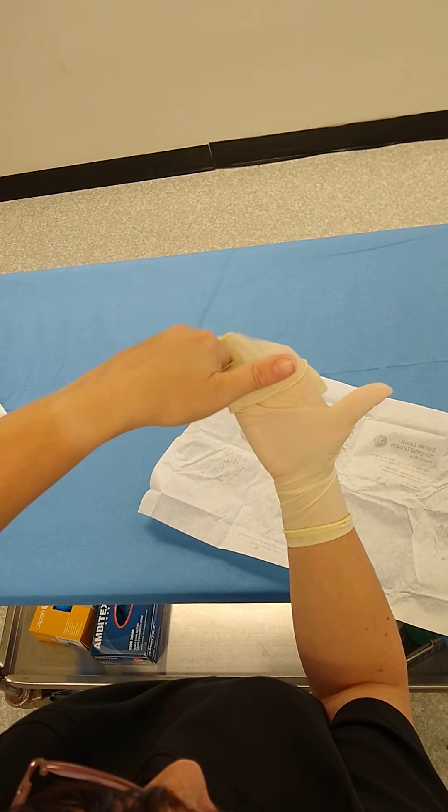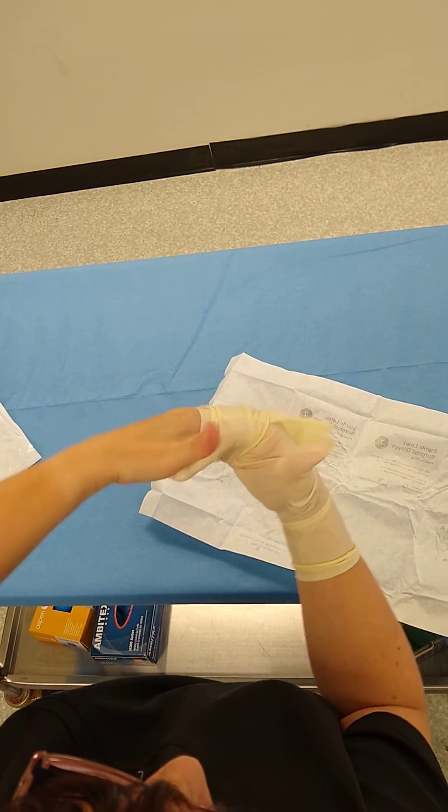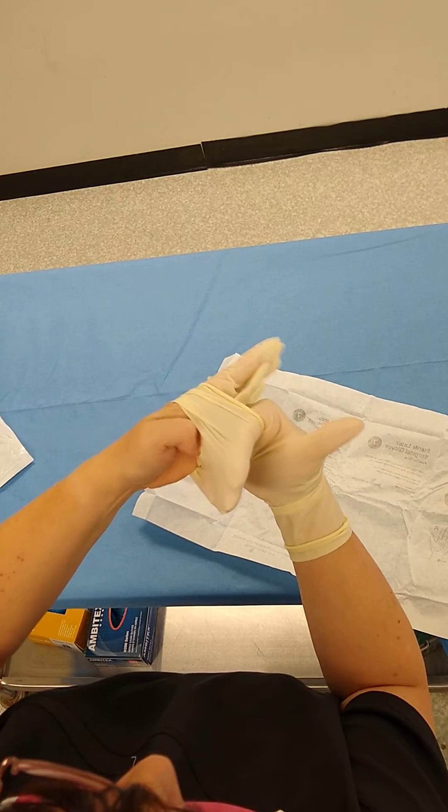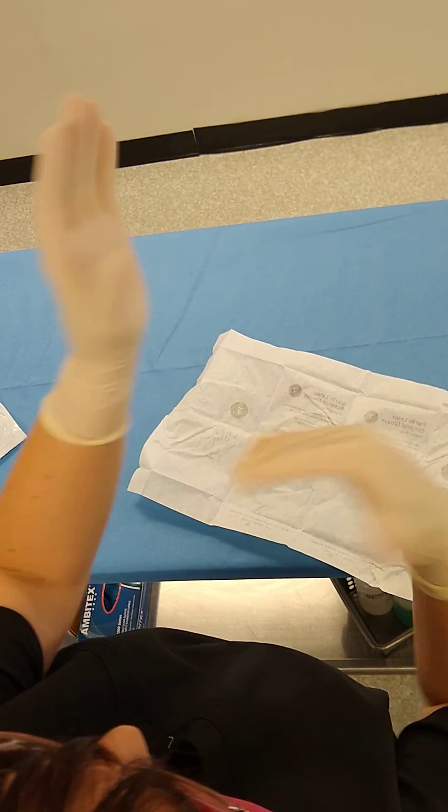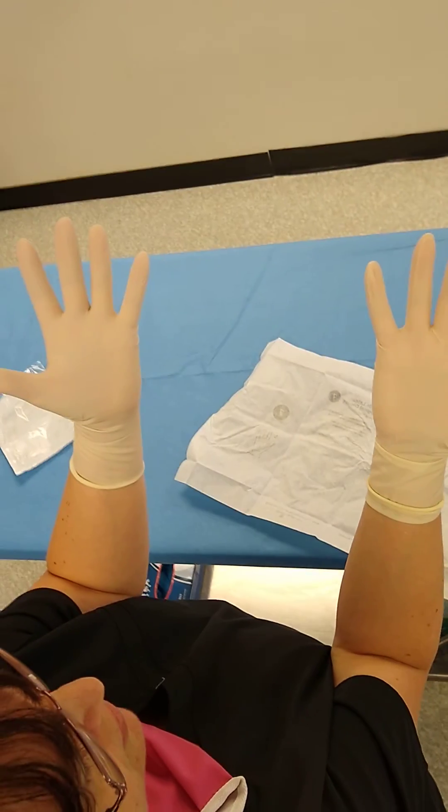Find your hole, slide your fingers in, and see how I keep my hand inside? And you have now open gloved.